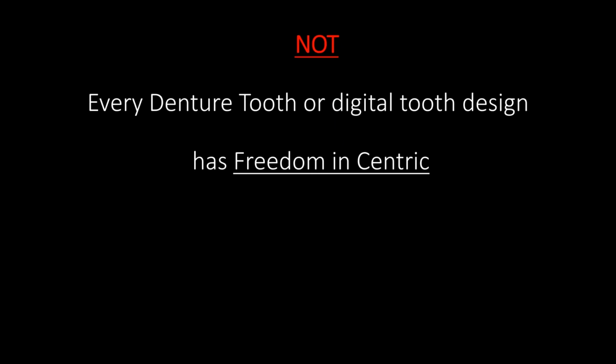And one of my biggest aha moments in my career is that not every denture tooth or digital design has freedom in Centric. What I just showed you exists, but it's not in every denture tooth that we buy and use. It's only a handful of teeth that incorporate this globally.